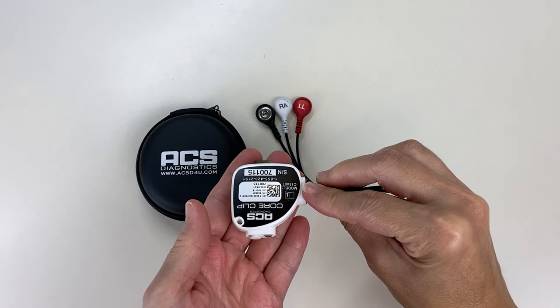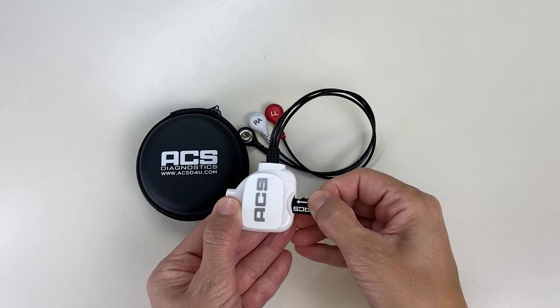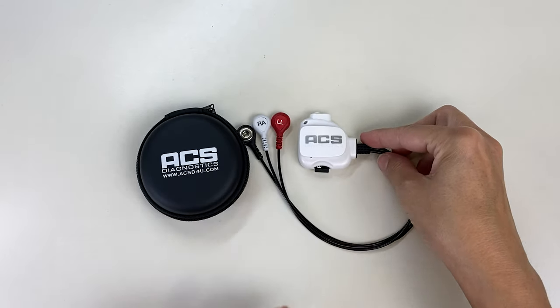While the patch can cause skin irritation and provide inaccurate readings, the Core Clip has two channels of standard electrodes which allow for greater patient comfort and more accurate readings. The clip is reusable, providing lower patient cost and higher clinical revenue.